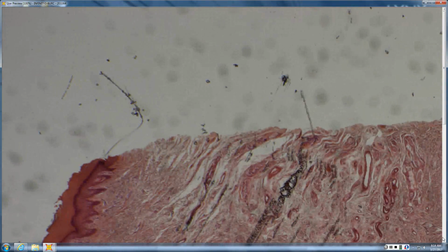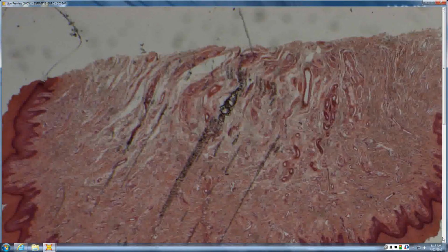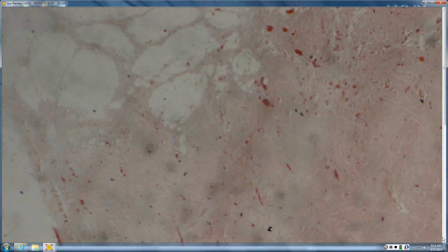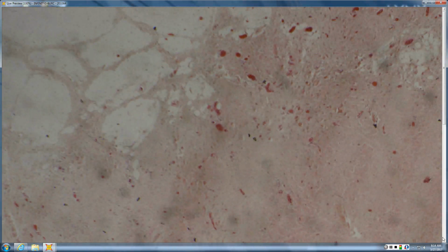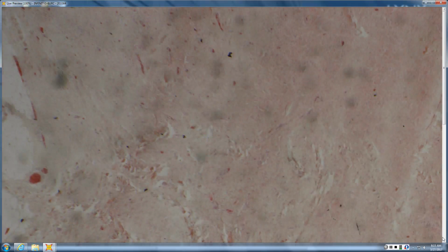Okay, what would this be on acral skin with vertically oriented nerve fascicles and vessels? An accessory digit. Supernumerary digit or accessory digit. Very good. Okay, patient has a midline lesion on the frontal scalp, but you are fearless, and so you excise it.